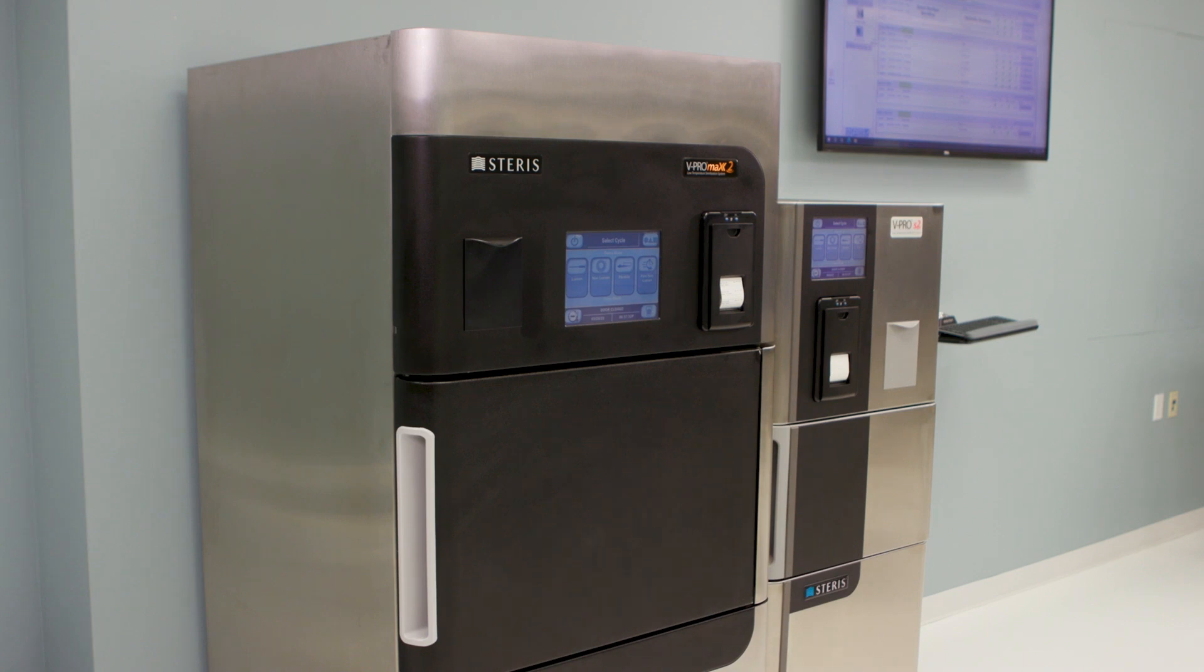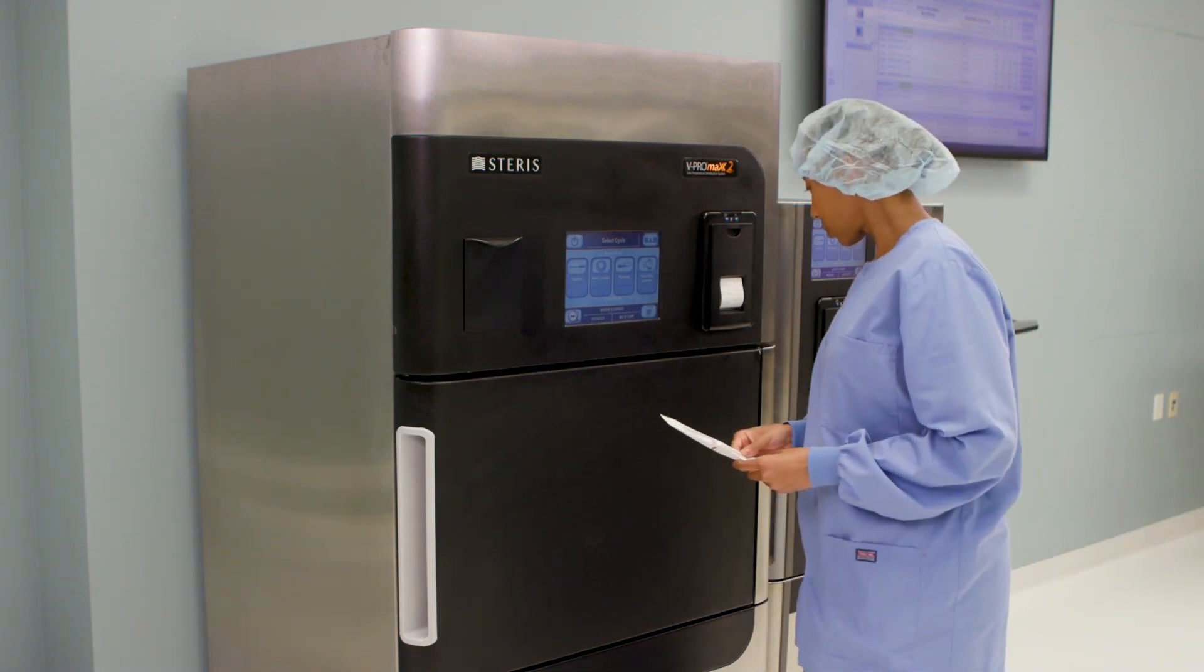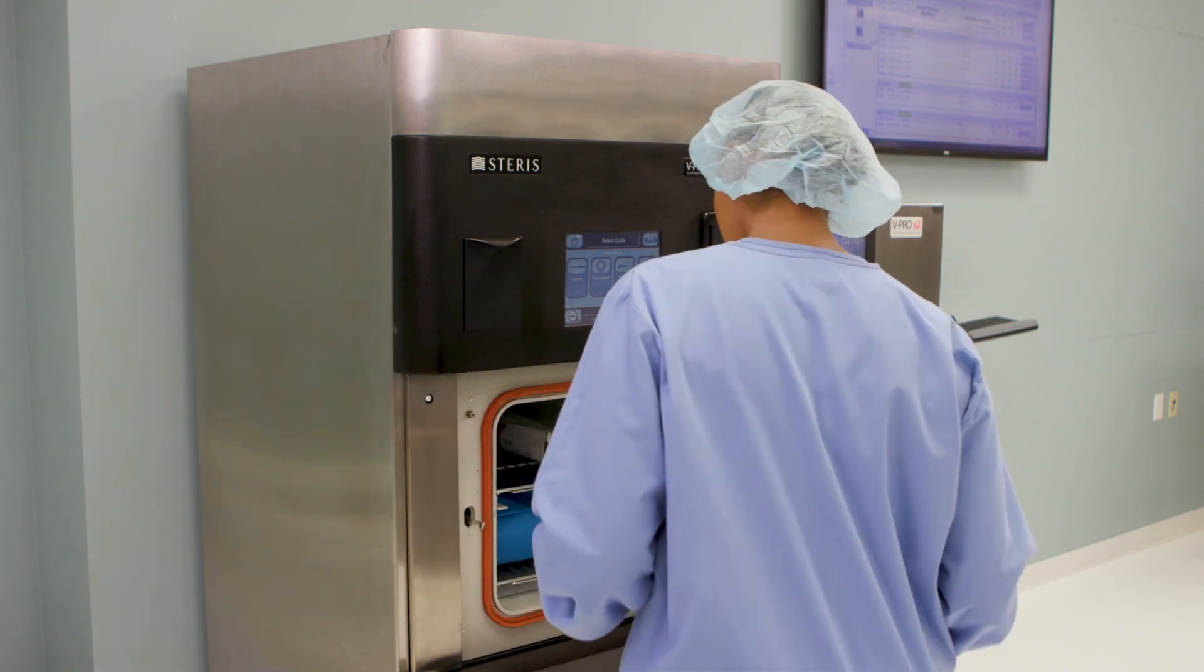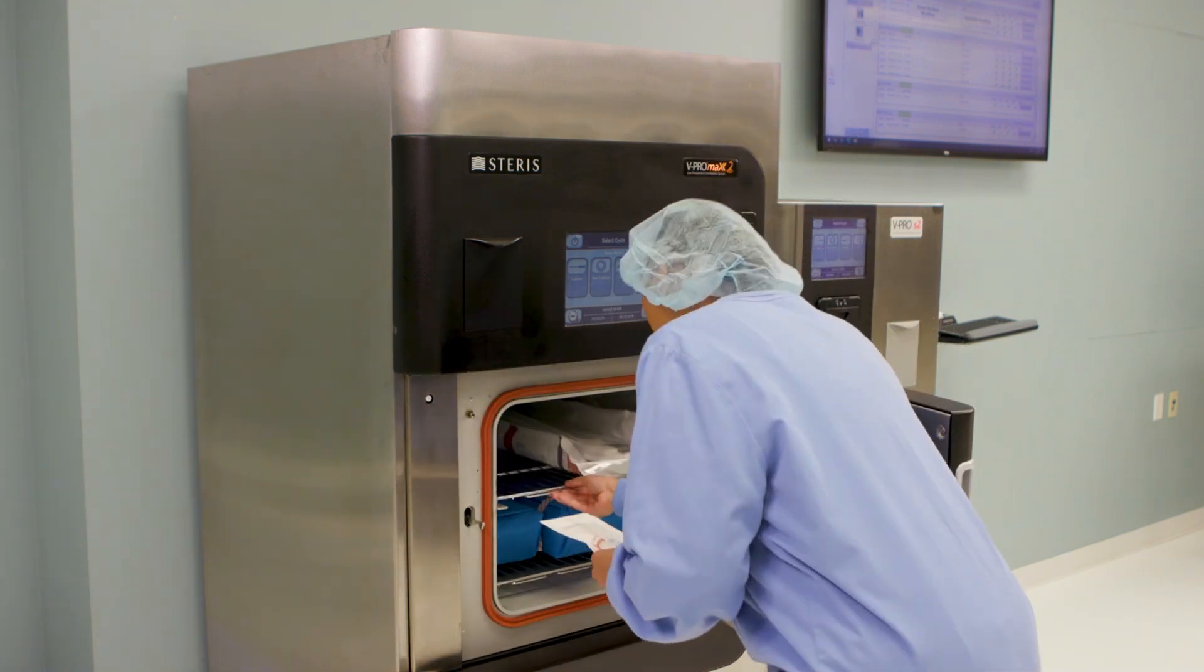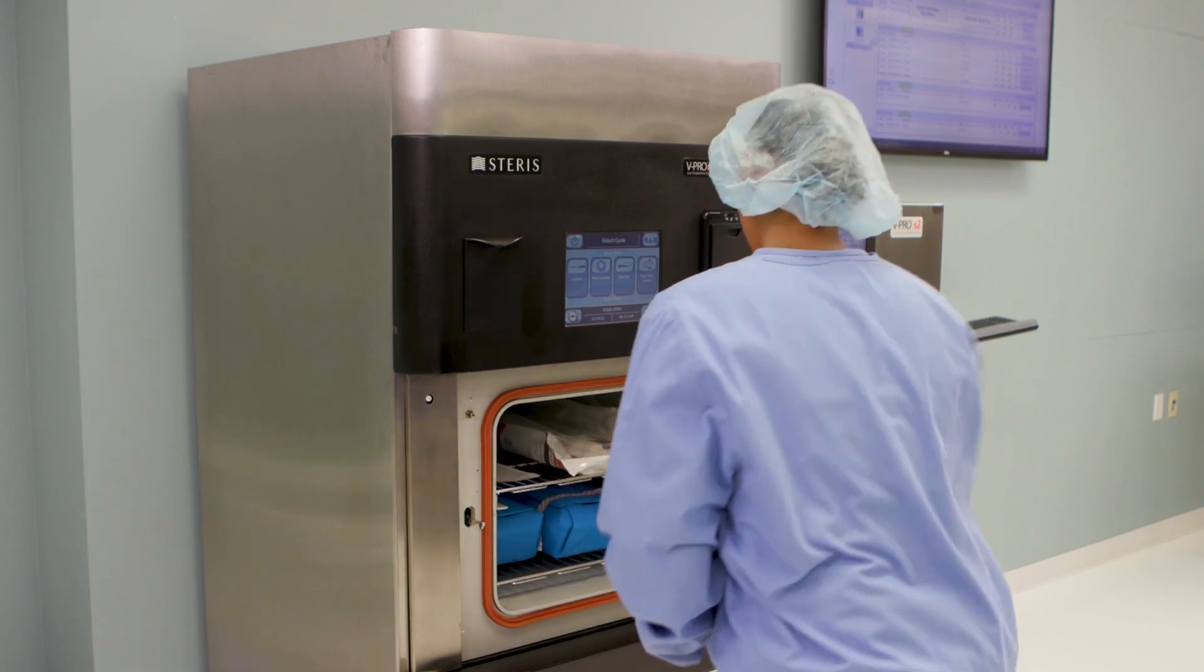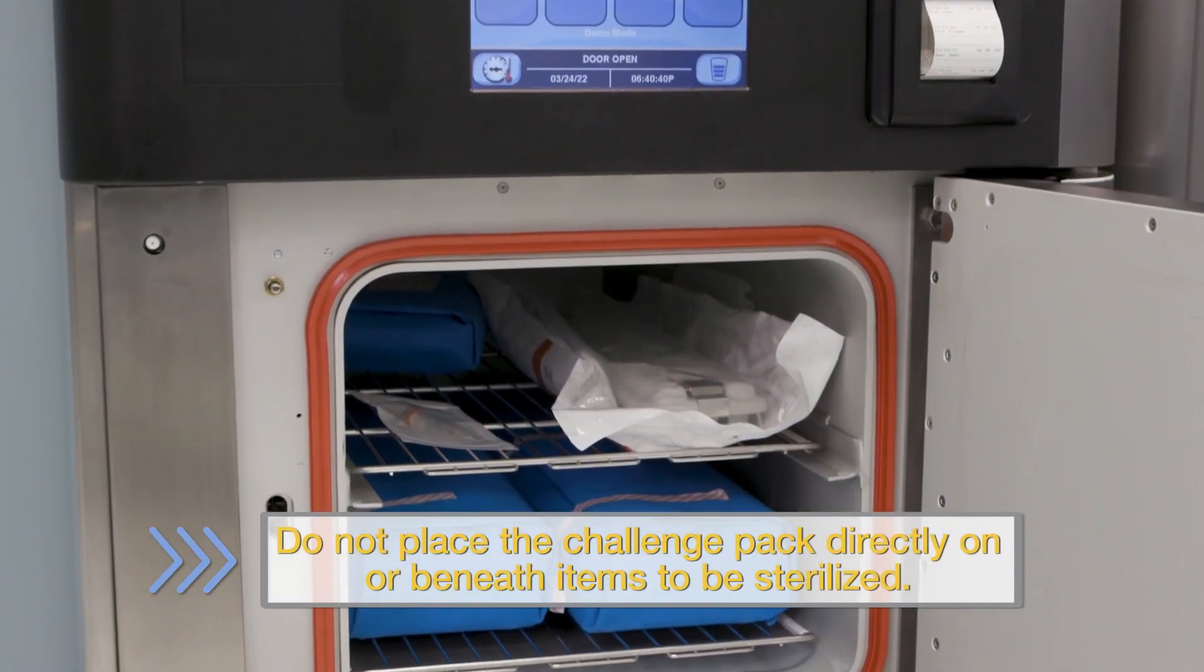Place the pack in the most challenging location of the sterilizer. In VPRO sterilizers, this is the center of the top shelf or close to the door on the bottom shelf if the top shelf is not installed. In STERAD sterilizers, this is on the bottom shelf close to the rear of the sterilizer.